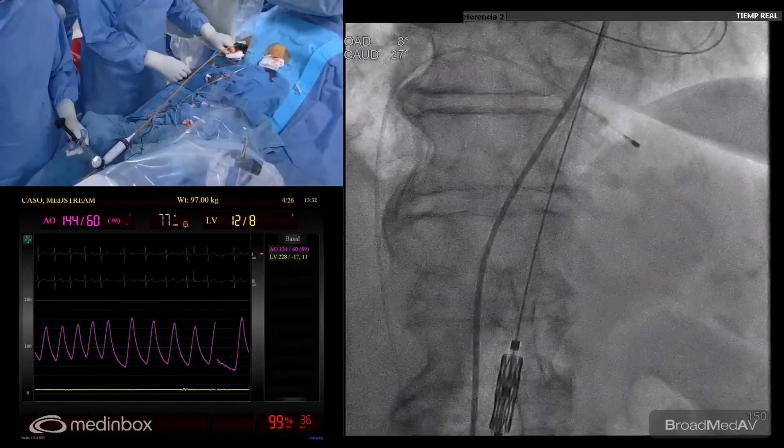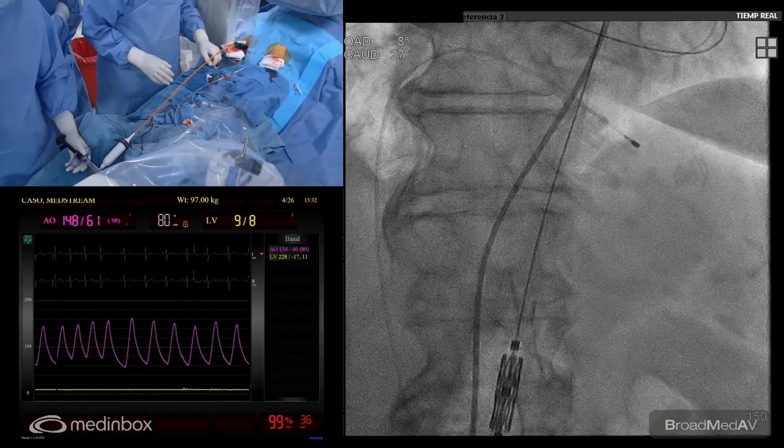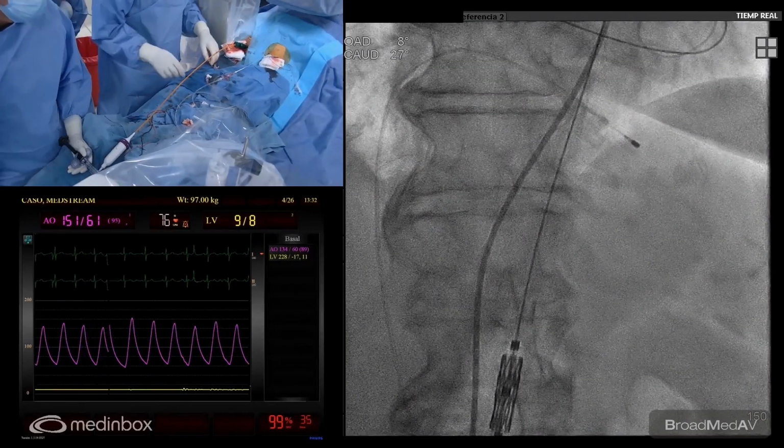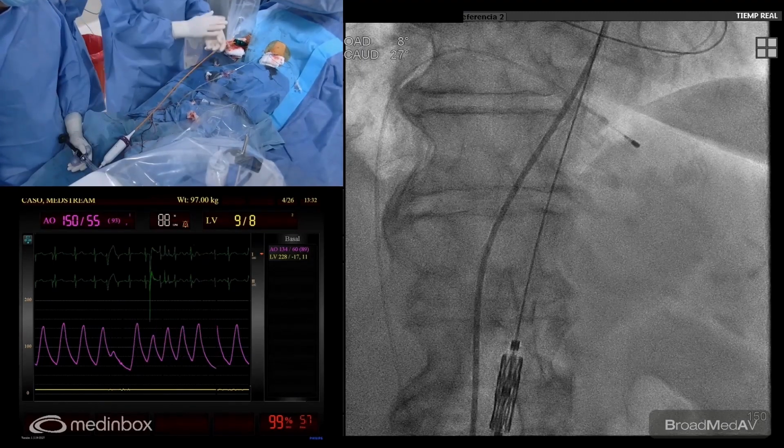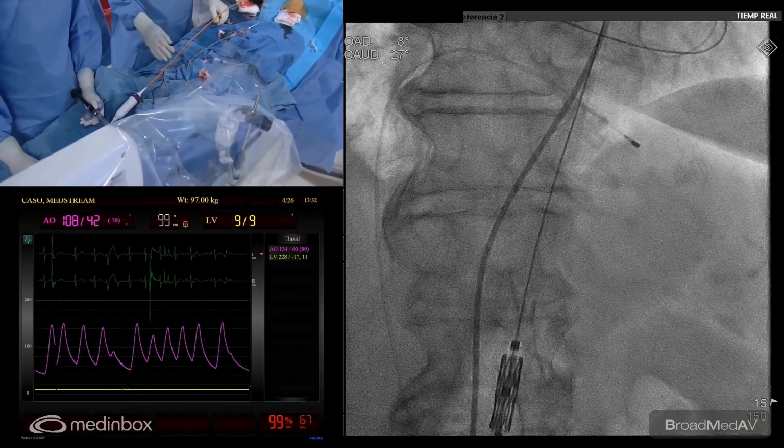As you see, this is a check that the valve is in the middle of the balloon because you have the points that are very well distributed. So this is a good check, and now we know that we are fine.